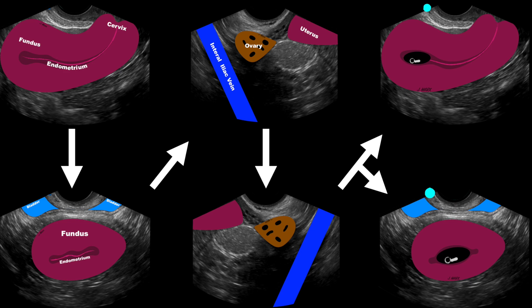The transvaginal protocol mirrors the transabdominal approach: we start with the probe marker towards the patient's head in a long axis view, scanning from right to left; then rotate towards the patient's right, scanning from the fundus to the cervix in a short axis view; then right adnexa, left adnexa, and then any pregnancy-related contents or adnexal masses or structures that we identify.